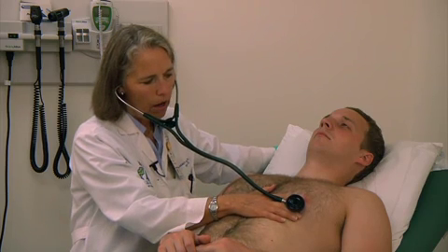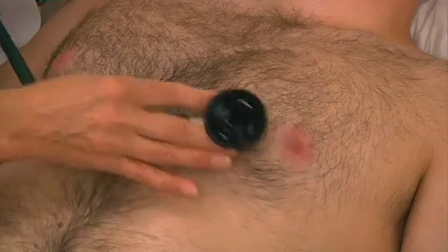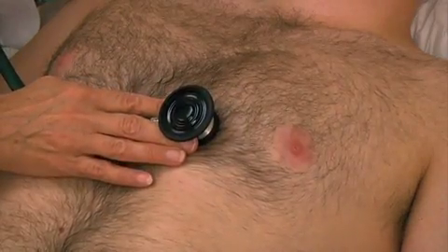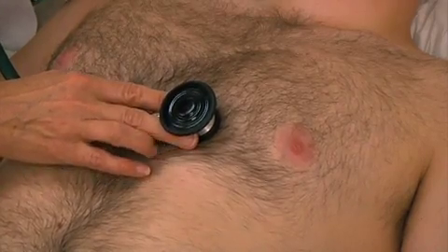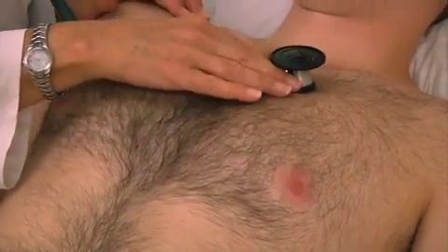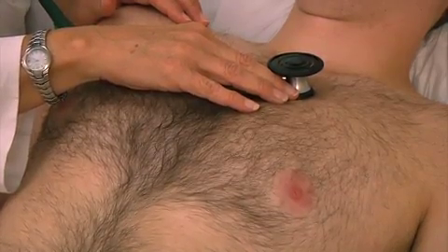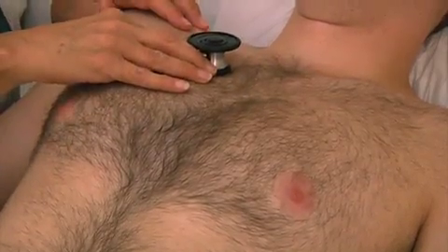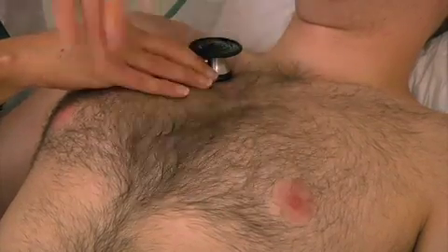So I listen with the bell in the mitral area, the tricuspid area. And I typically listen to the pulmonary and aortic area with the bell as well, although you don't pick up many low-pitched sounds here. It's primarily here.